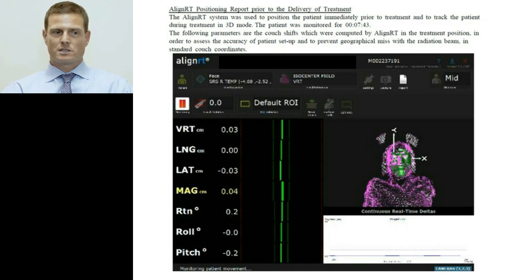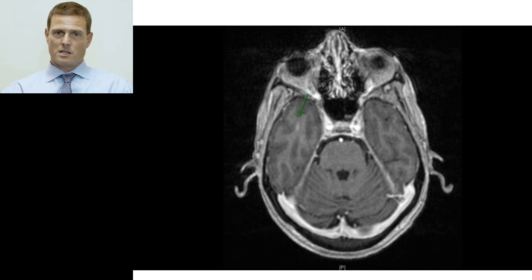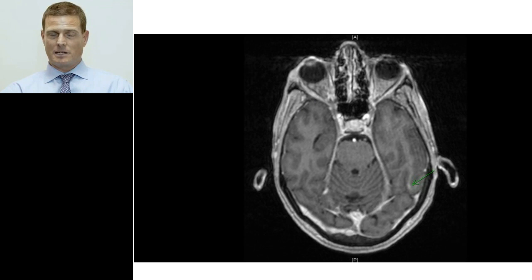This is her most recent MRI. It's about 2 months following this treatment. There's just a wisp left of that metastasis and that metastasis as well, but essentially a complete radiographic response, and she's had no toxicity from this nor her previous radiosurgery, so we wish the best for her. But should she develop limited volume brain disease again in the future, we would opt again with a continuation of radiosurgery as long as it's feasible.